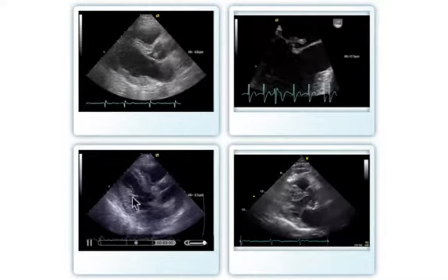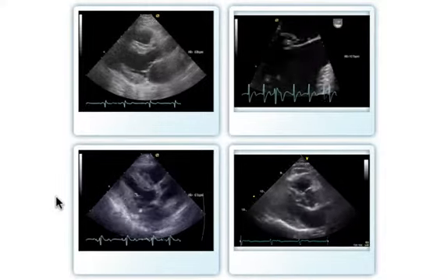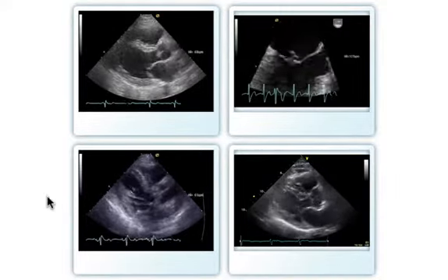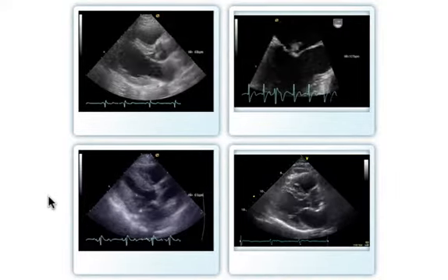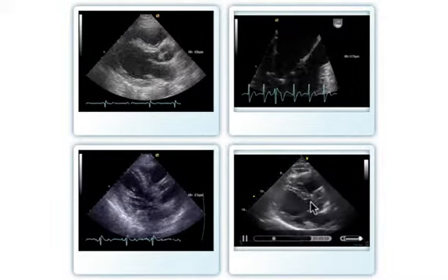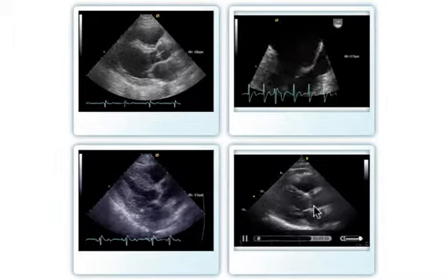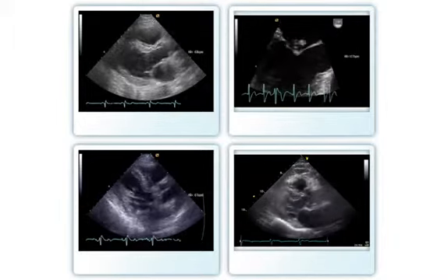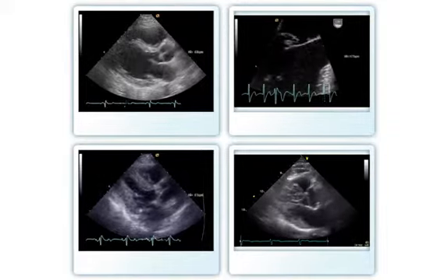And this small structure here, which also appears to be mobile and seems to look like endocarditis, was not endocarditis, but just a ruptured aberrant chordal string. And on the aortic valve in this patient, we have string-like structures. What are they? No endocarditis. Those are Lambl's excrescences.